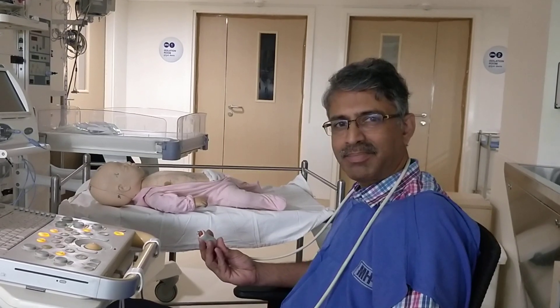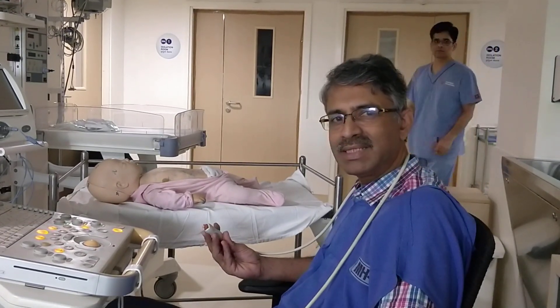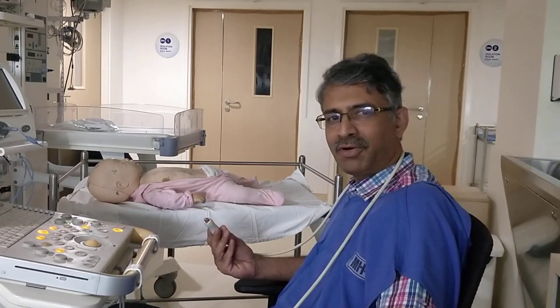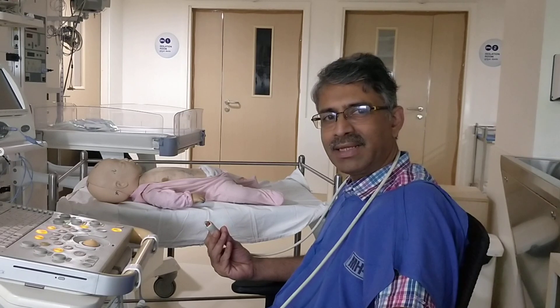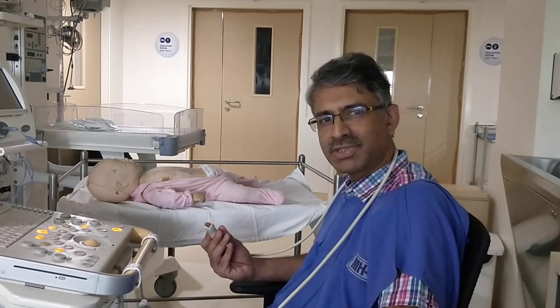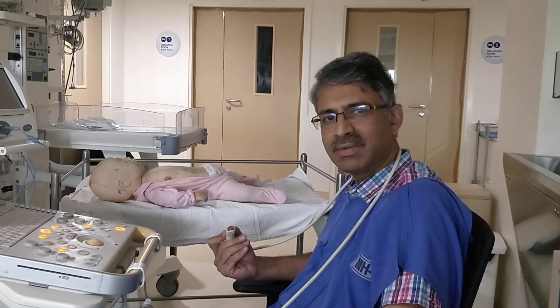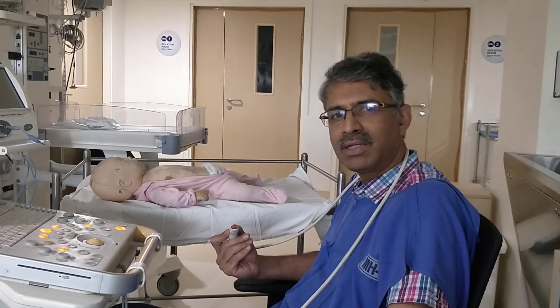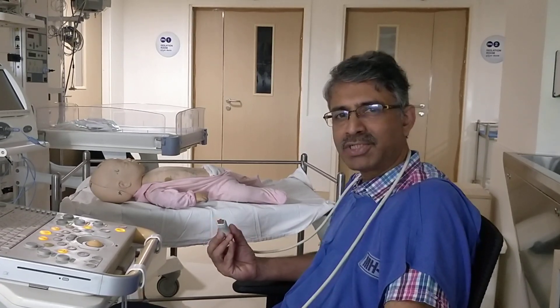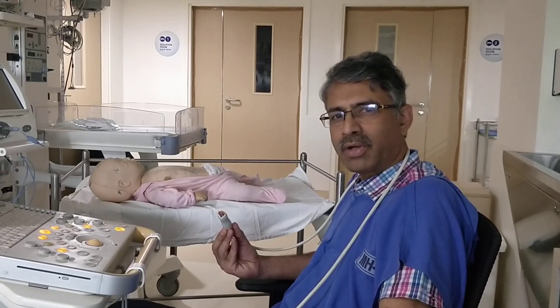Patent ductus arteriosus is one of the important cardiac morbidities we see in preterm neonates. Before considering the management of patent ductus arteriosus, it's always better to rule out structural heart disease, which requires complete cardiac evaluation. Let us demonstrate how the PDA is picked up on echocardiogram.